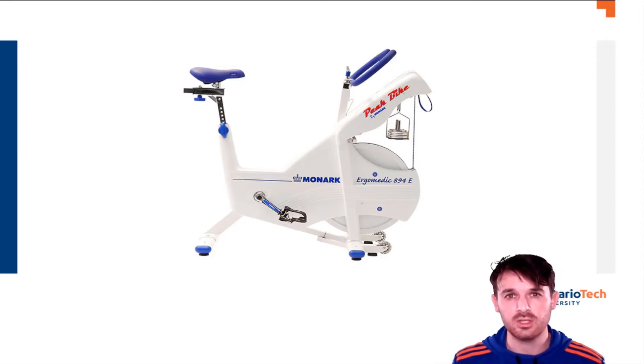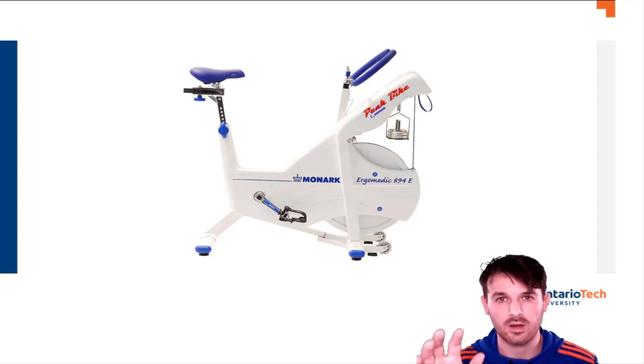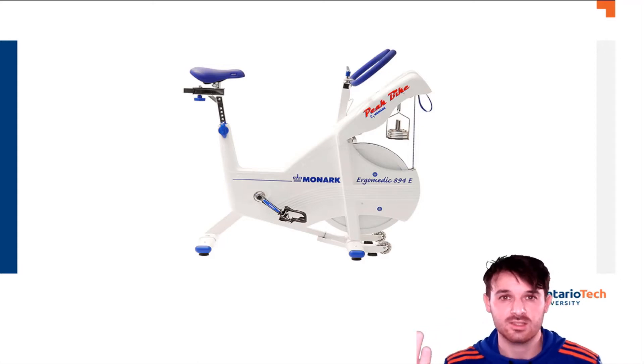We typically use this bike because it allows instantaneous application of the exact prescribed load. More expensive electromagnetically braked bikes exist, but even our older Monarch electromagnetically braked bike takes about 10 to 15 seconds to apply the total load — and knowing this is a 30-second test, the test would be half done by then.